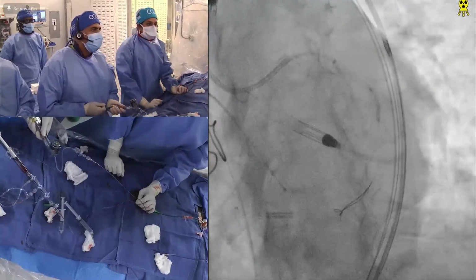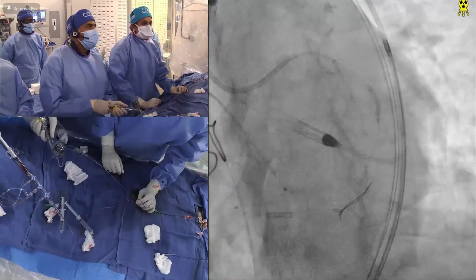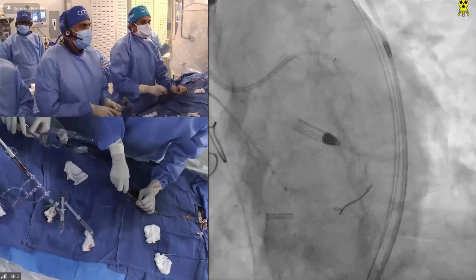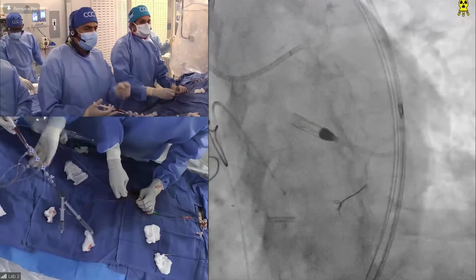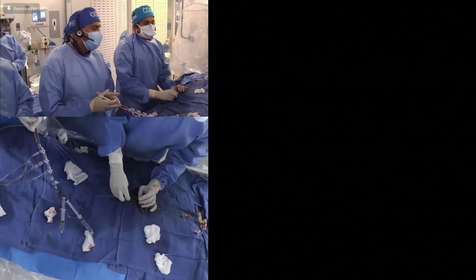So I think in this case, if you're okay, we can just see the picture, show it. If it looks good, we can go back to the other room to see how you did, and maybe to the third case, because we only have 11 minutes. My case was simple. We dilated with a 4-0, fantastic. The lumen is probably 9 millimeters square.